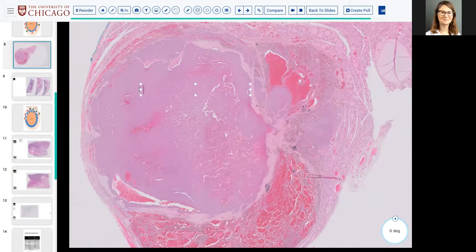So I'm a little bit cautious with Hürthle cell neoplasms, but the good thing is minimally invasive Hürthle cell carcinoma, or for that matter, follicular carcinoma, atypical Hürthle cell neoplasm or follicular neoplasm, and benign, infarcted. Is the treatment going to change for any of these?